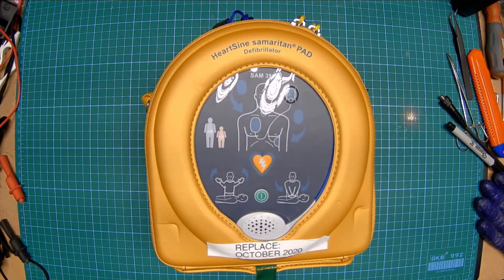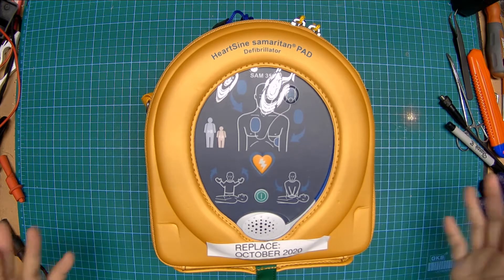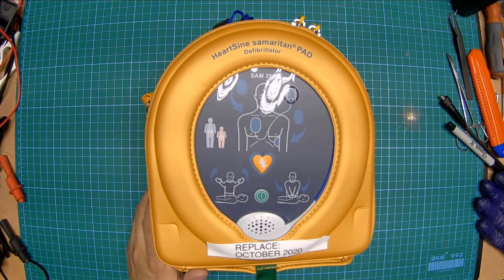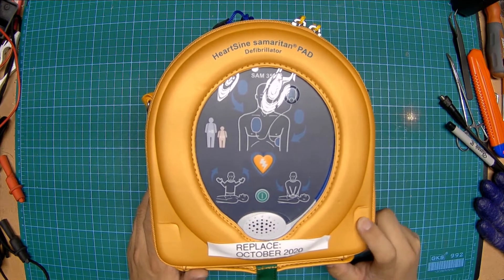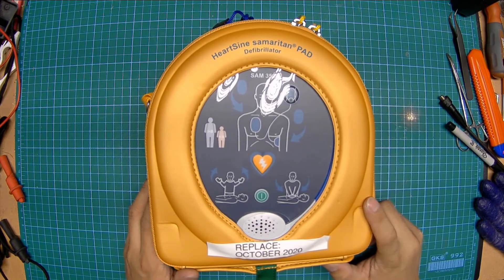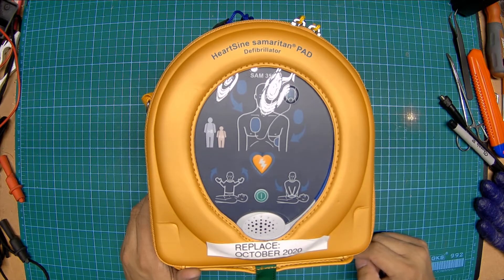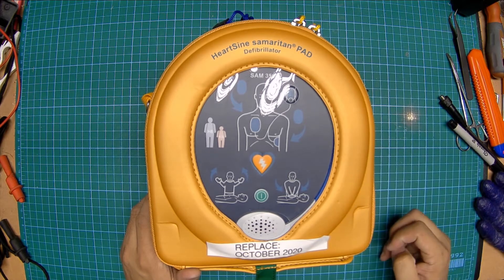Overlapping hands. Hello YouTube. Today I'm going to screw around with an automatic external defibrillator and we're going to find out what happens. I got this unit because work was retiring it. It had been in service for quite some time, and they accidentally didn't realize that the unit itself doesn't expire — only the pad and battery cartridge expires. So I got a free AED to screw around with.